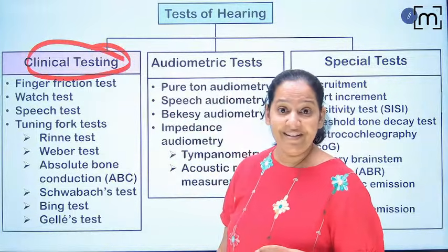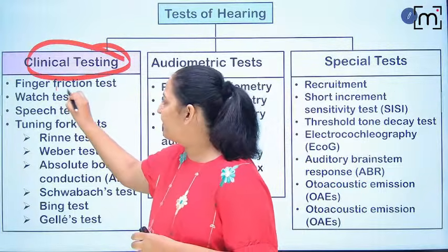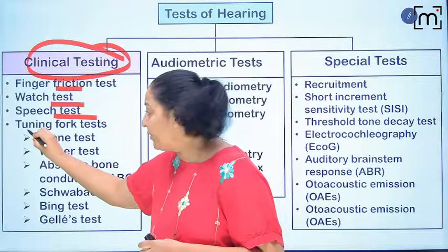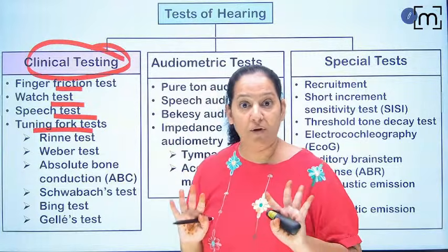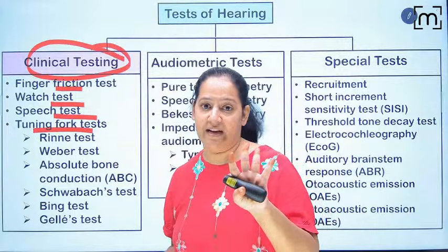How many clinical tests are there? There are 4 clinical tests. What are the 4 clinical tests? Finger friction test, watch test, speech test, and tuning fork test. First, you learn the 4 names. I'm teaching you clinical test. There are 4 types of clinical test.